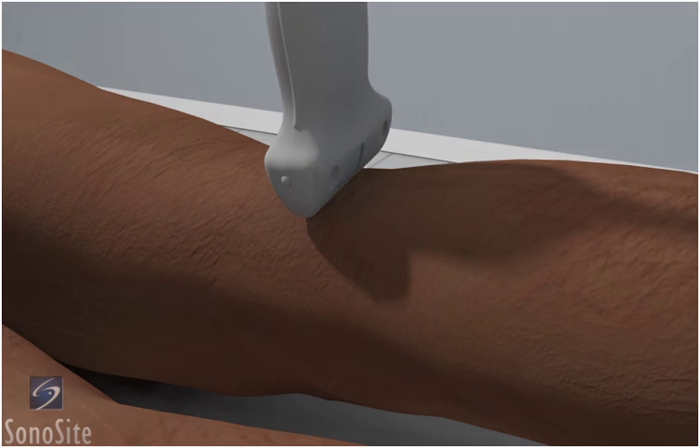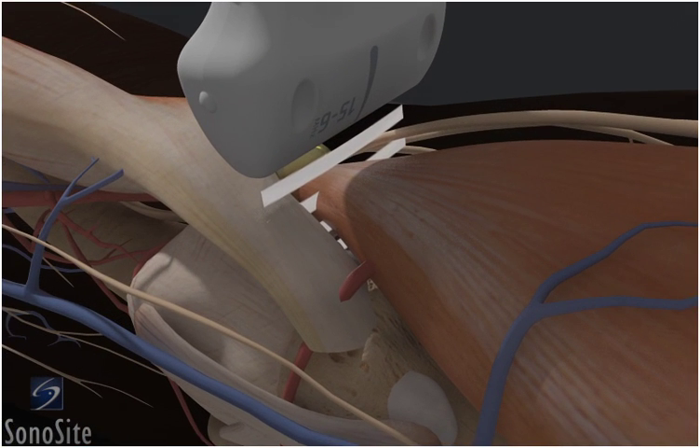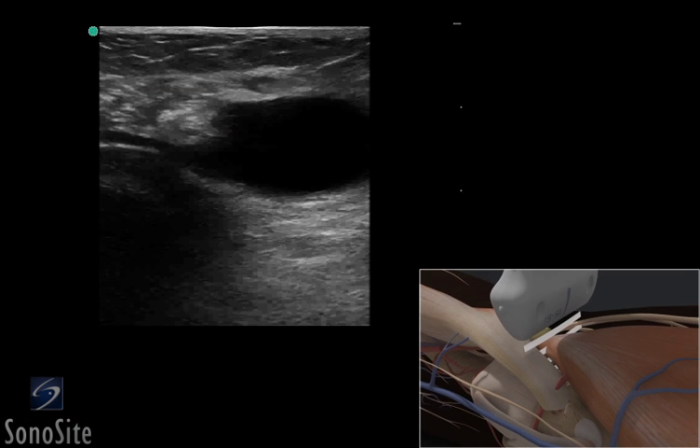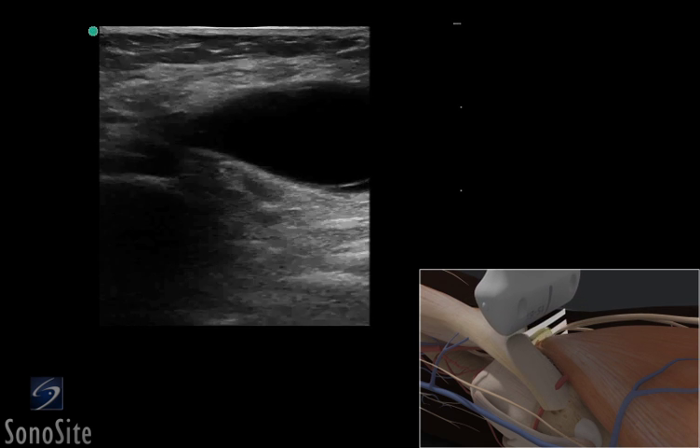The transducer is placed transversely over the popliteal fossa with the orientation marker directed to the patient's right. The most common location for a Baker's cyst is at the crossing of the semimembranosus muscle and the medial head of the gastrocnemius muscle above the femoral condyle.